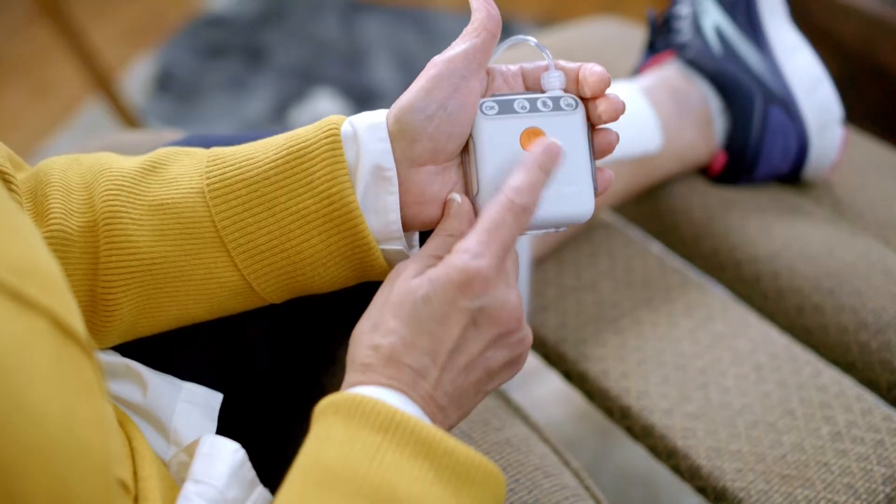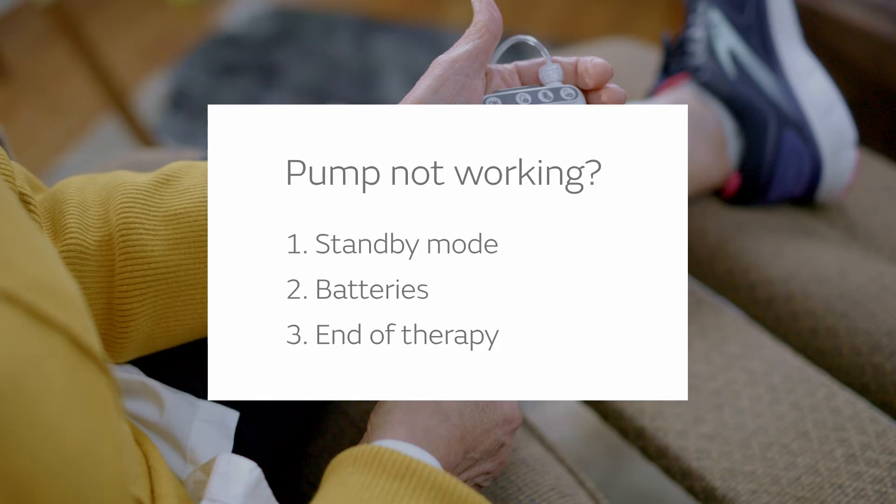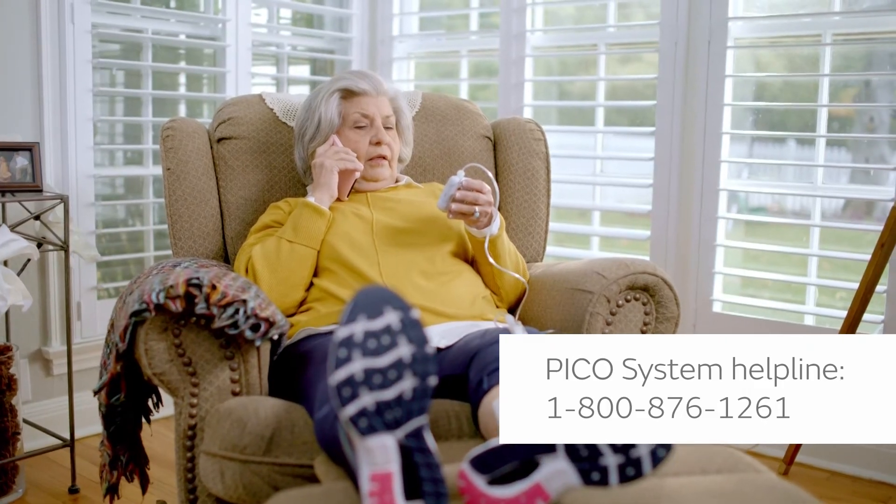If your pump has stopped working, that could mean one of three things. One, you're in standby mode — press the orange button to restart. Two, the batteries need to be replaced. Three, you've reached the end of your 7- or 14-day course of therapy. If none of these situations apply, contact our helpline for assistance.